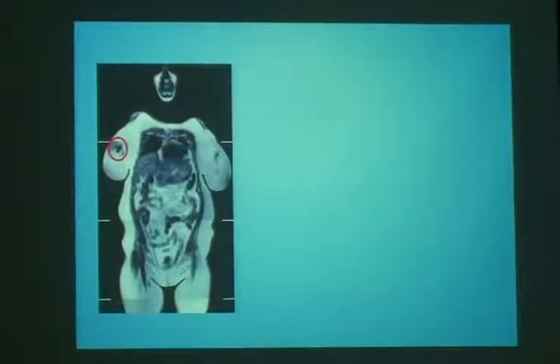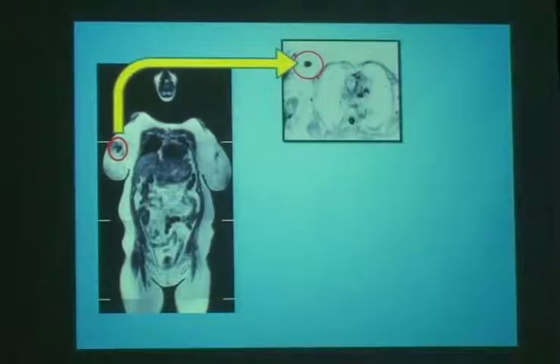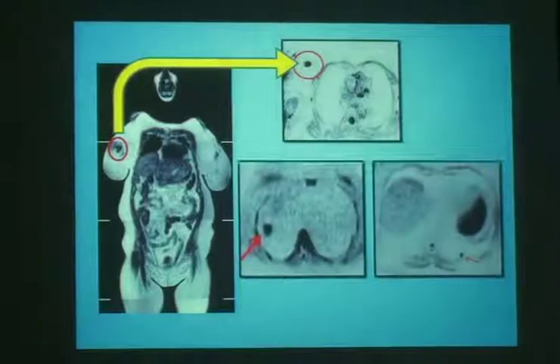This is the same patient. This is the primary breast lesion, because as we said, this was the initial setting. The diagnosis was just about a week before we performed the studies. This was a typical MR feature of irregular outlines of the breast lesion with diffusion restriction, and in this study, we also found pulmonary metastasis.